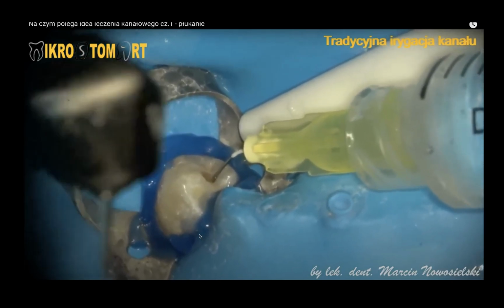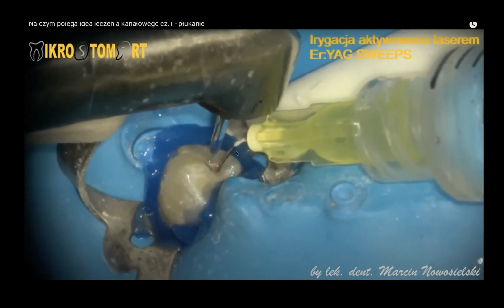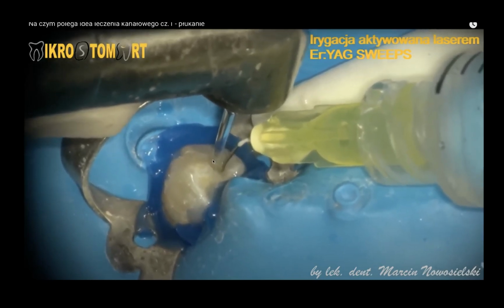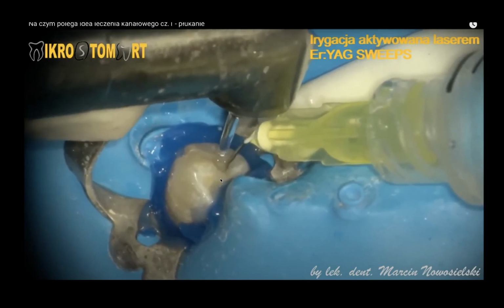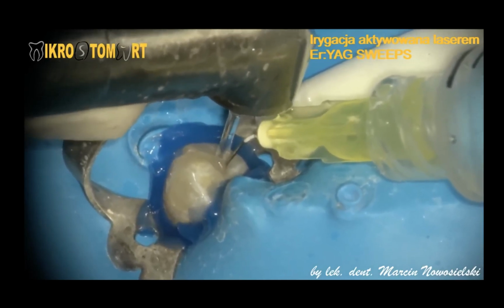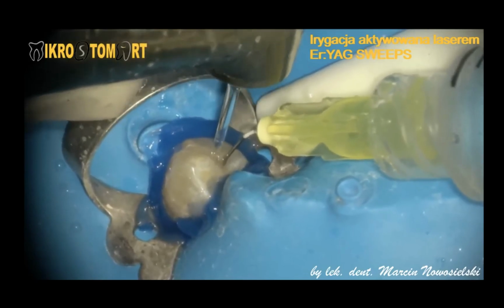This is the standard irrigation, when you just use irrigant solution from the needle, and here we use erbium-YAG laser to activate this solution. Erbium-YAG laser absorbs very well in water and causes the irrigant fluid to go everywhere.